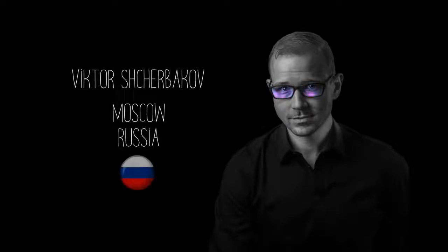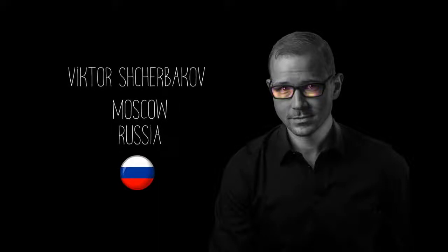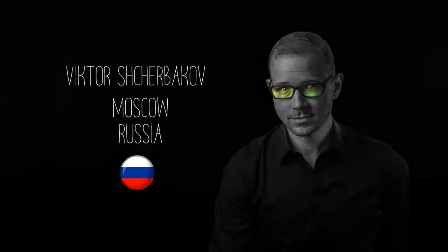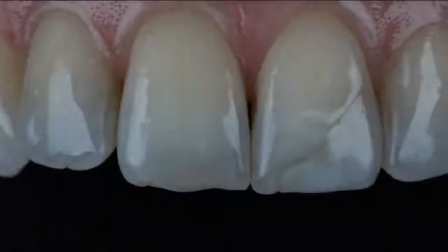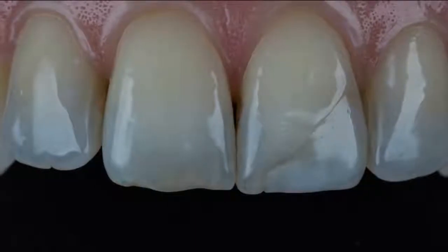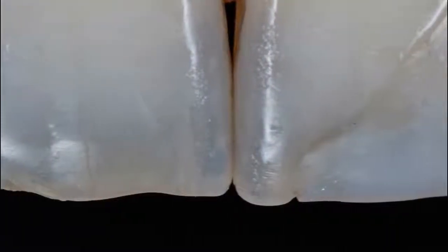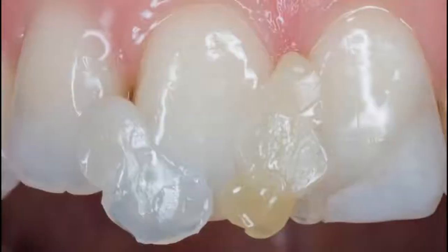This video demonstrates the clinical case of composite restoration of a class 4 incisor defect. As you can see here, I face quite a complicated structure of the cutting third. Such optical features, which we can compare with some amber effect, appear because of the high level of abrasion. And of course, the main issue here is the concrete formulation of shades and their combination.